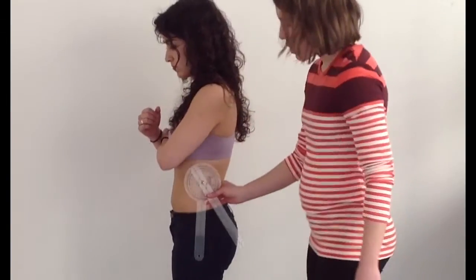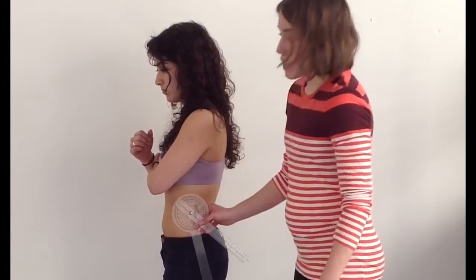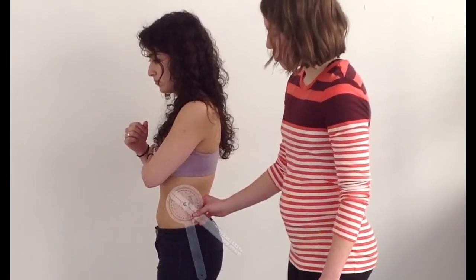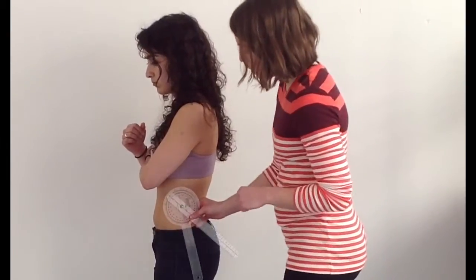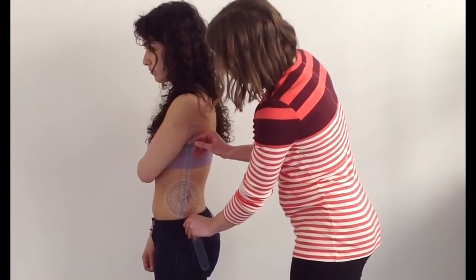And then your stationary arm is going to be along the midline of the pelvis. You want to keep it along the midline of the pelvis and not vertical to the floor, so you don't take into account hip motion when you're doing lumbar extension. And then your moving arm is going to be aligned along the mid-axillary line.